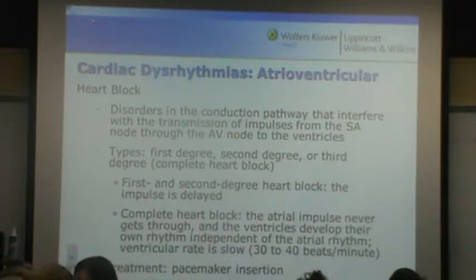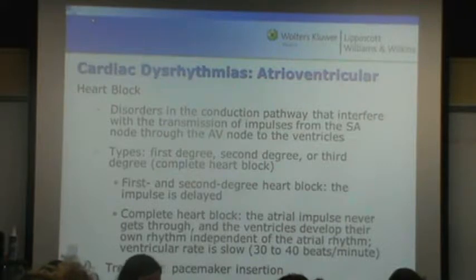No. This one, I'm sorry. I told you to go on that one. That one is actually an atrial flutter. It's a 2-to-1 conduction, and what happens is that QRS is jumping in on the second P wave there.